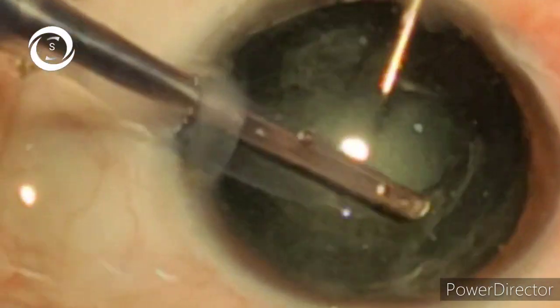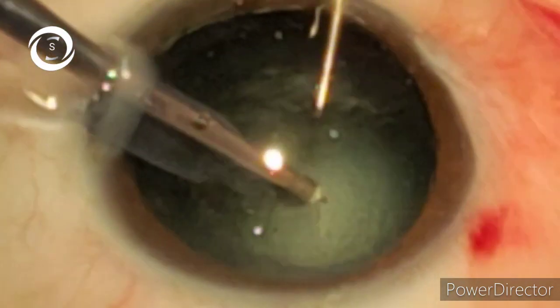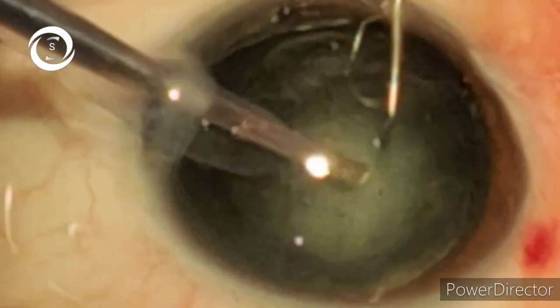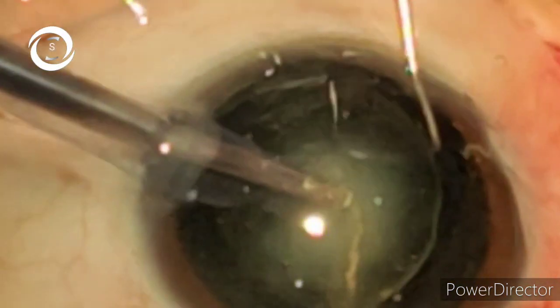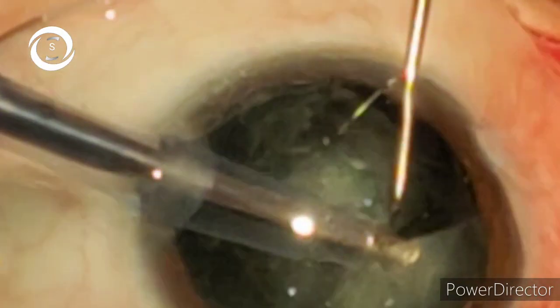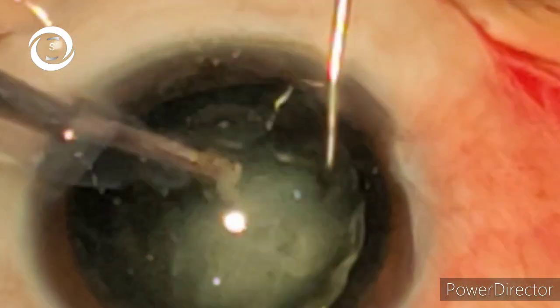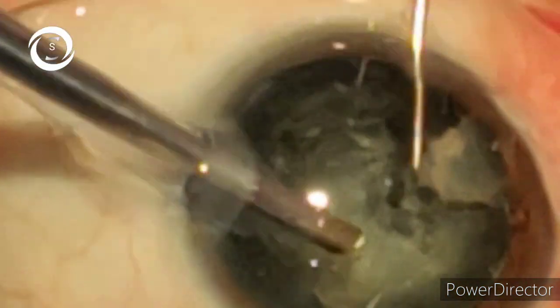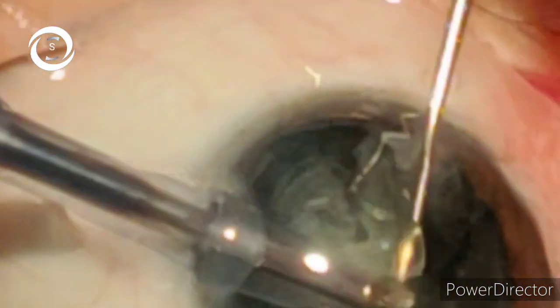Then slightly elevate the foot from the foot pedal and enter step 2 — now vacuum is functioning. Elevate the nucleus in step 2 and bring the chopper or dialer from behind and divide it easily. You can see here that I have engaged it and elevated it, and now you can see how with the help of a chopper I have divided it easily. The divided piece is further divided, as you can see here.